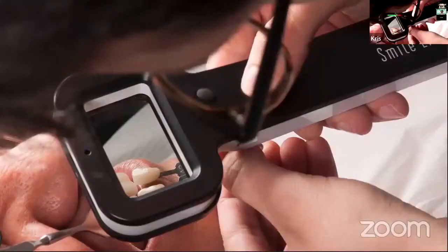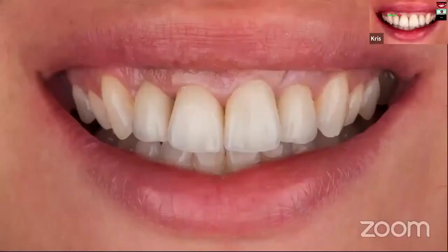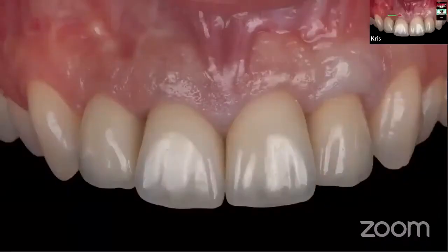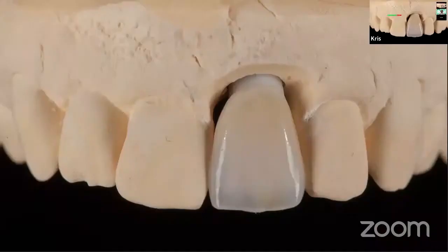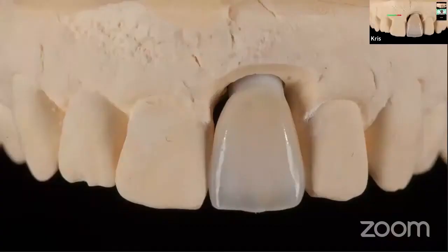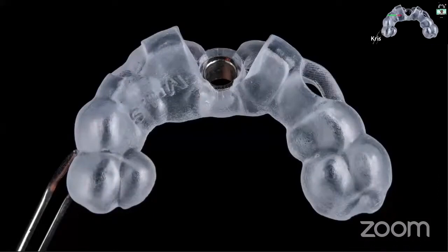Color and shade, the modern approach, I already showed you with this type of pictures, but this allows me, especially with the digital workflow, to handle cases like this immediately before the surgery happens. Here, the patient will lose central incisor number 21. And the goal was just to deliver, immediately after surgery, a perfect crown, in the same color and the same shape. So based on the information which we sent to the laboratory with cross-polarized photography, Nico was able to prepare such a crown. So then we could start the surgery.